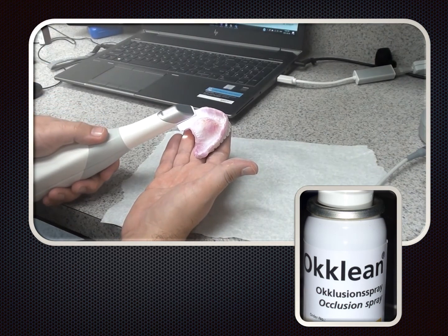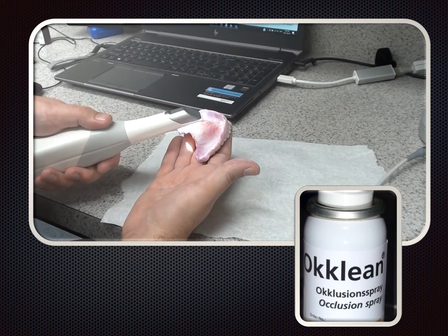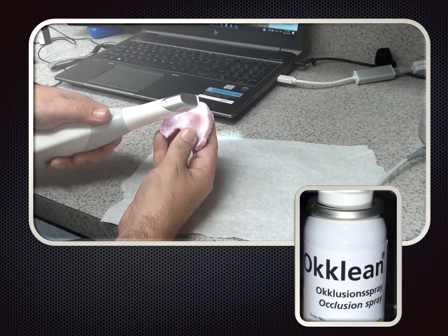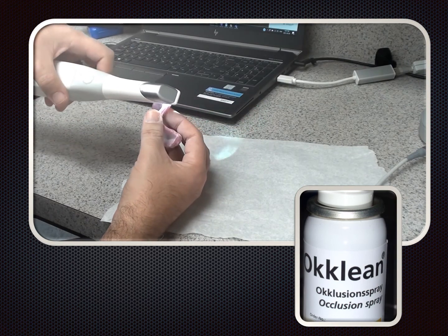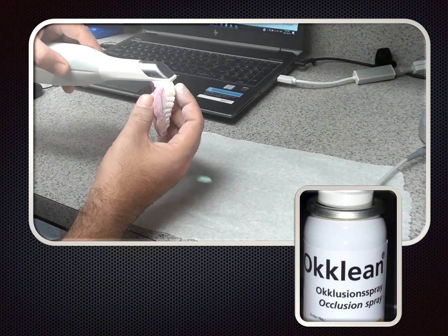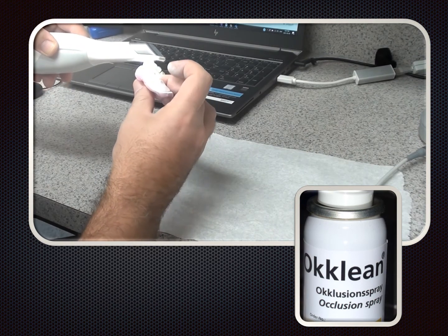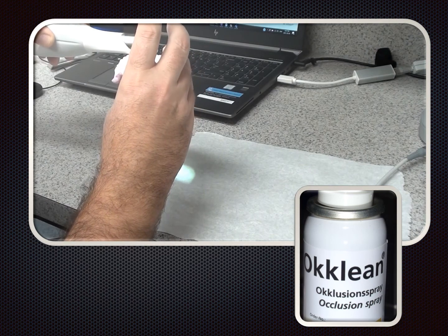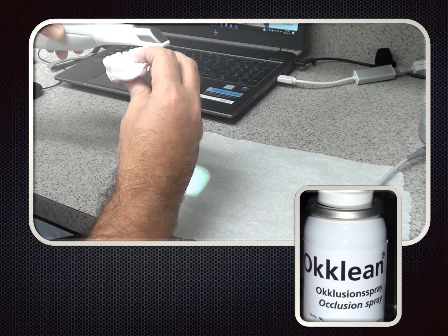Demonstrating the extra-oral denture scan here. You'll notice some white powder — powder is not necessary intra-orally or extra-orally, but I had a shiny spot on the denture creating a challenge, so I dusted it with occlusion spray to make it easier for the scanner. I've scanned the internal surface and am now rolling over to the buccal to pick up the facial surface and teeth. Also notice that I'm moving both the denture and the wand. Don't get trapped into only moving the wand as you would intra-orally — when bench-topped, move both. It's easier and allows you to capture all surfaces.